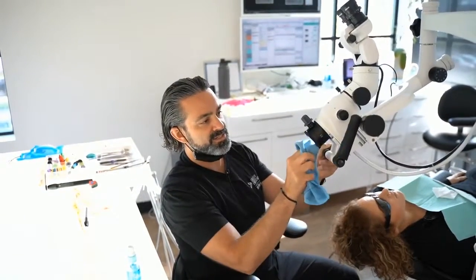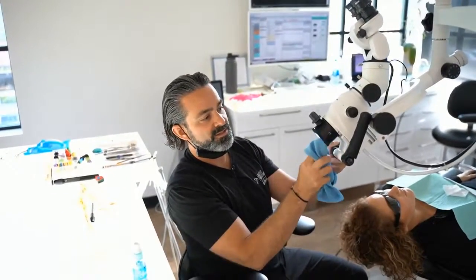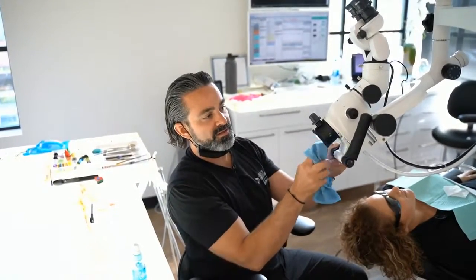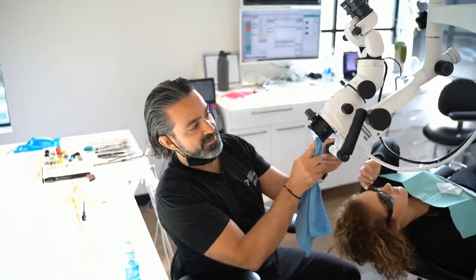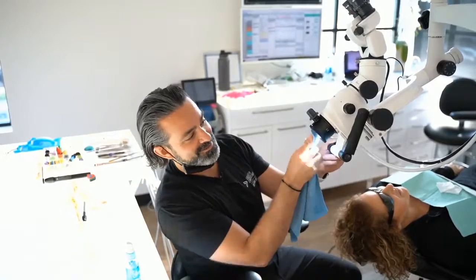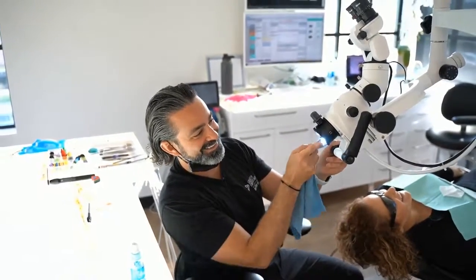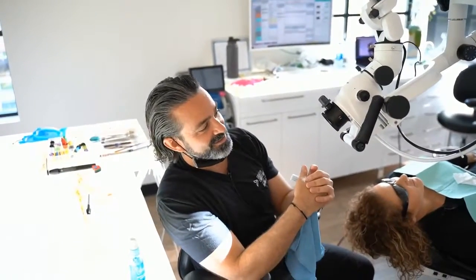And this is something my staff will do in between every patient regardless, because you get to be kind of a lens snob, which is why I cut my eyelashes. How many times have I said that? It's a test question. That's pure public knowledge, John.